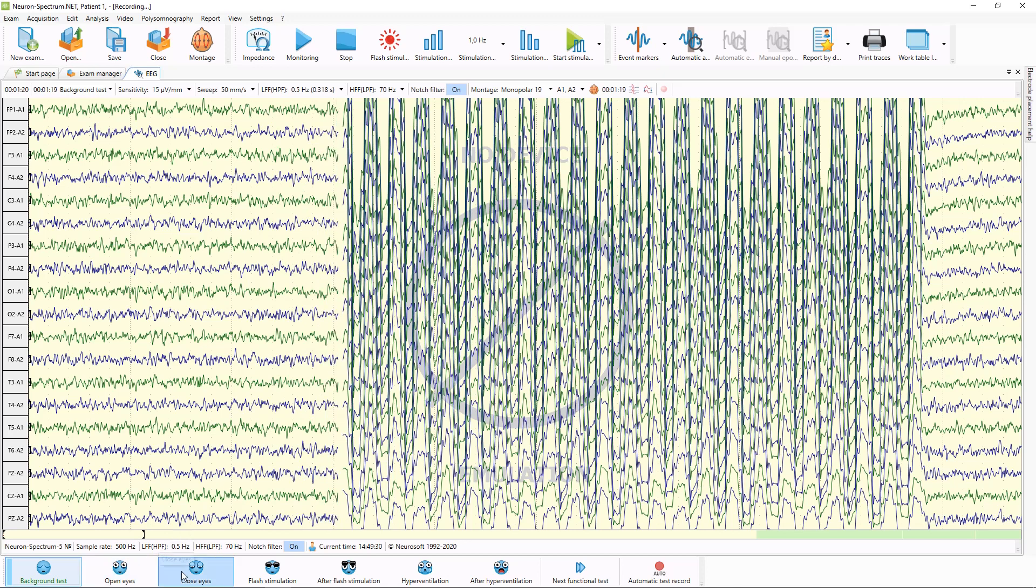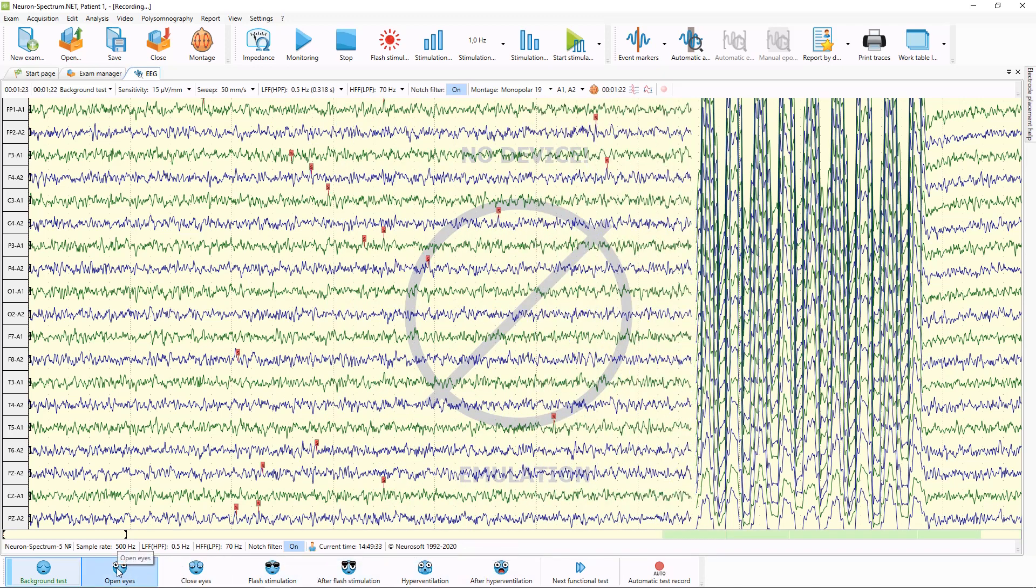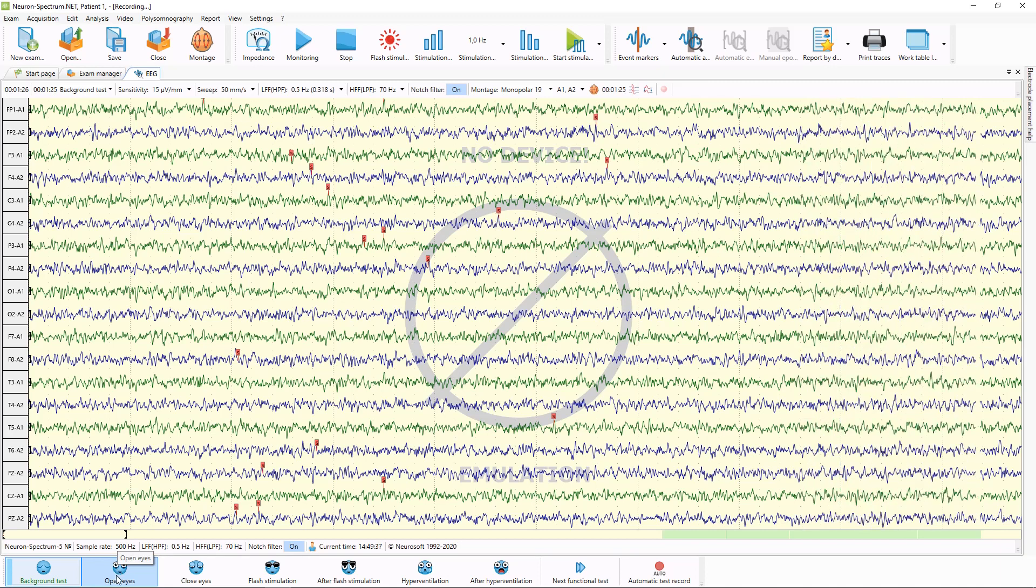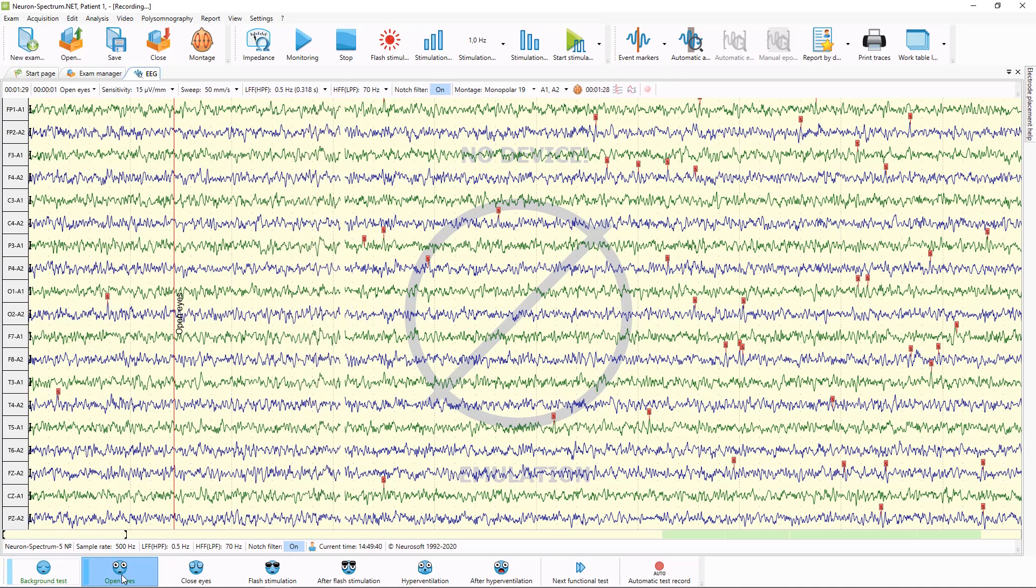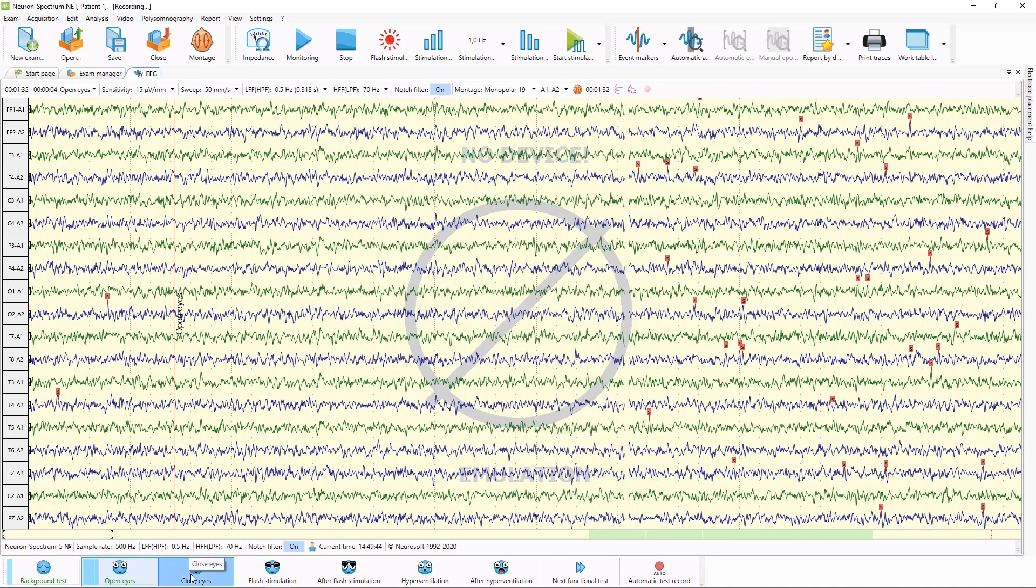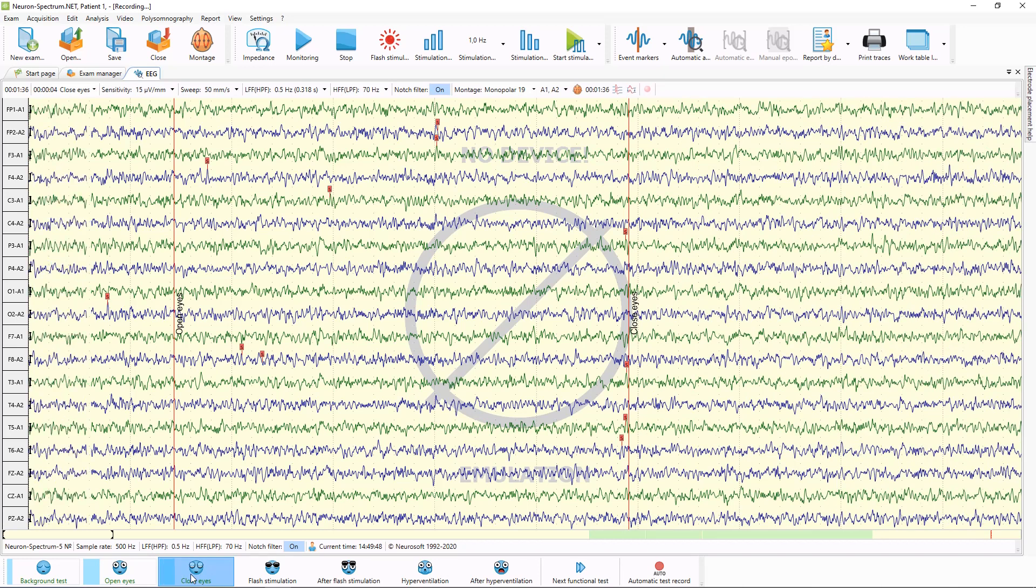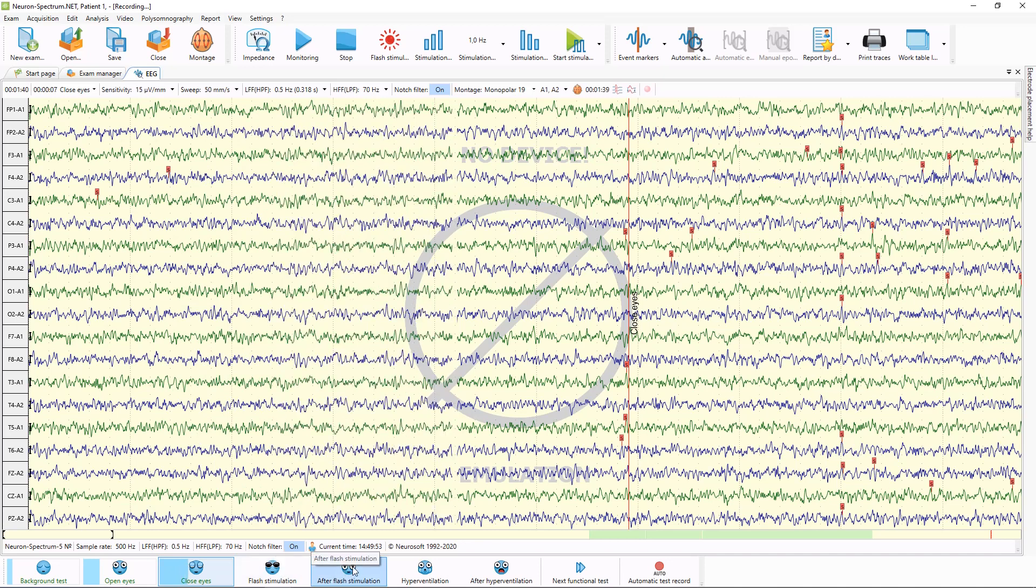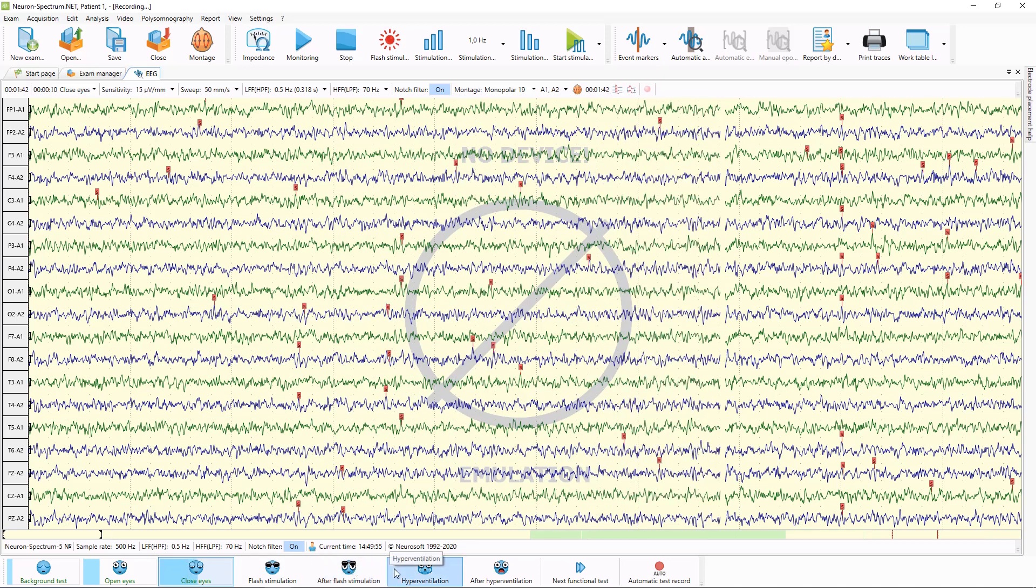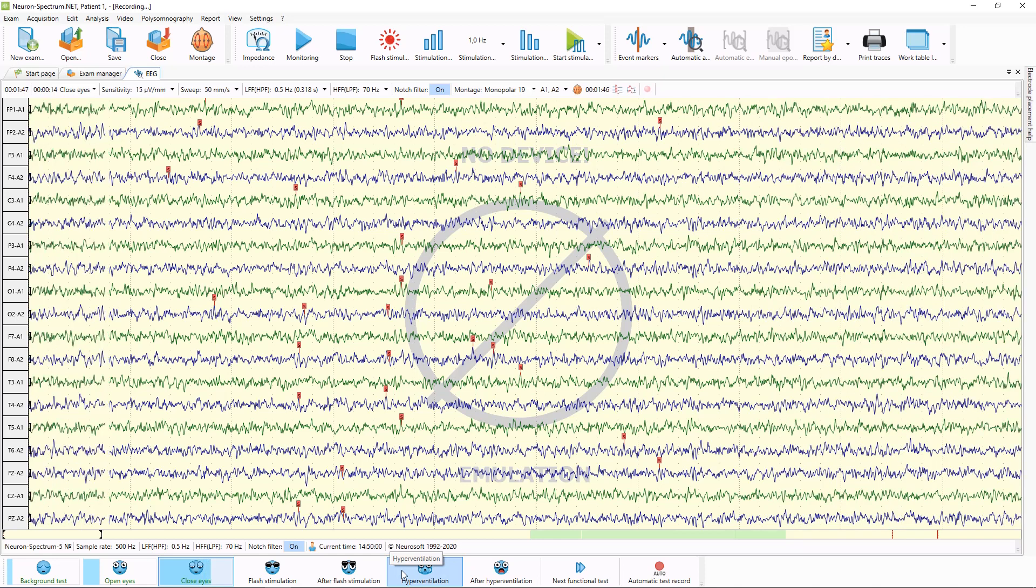Using these buttons, you can perform functional test recording. For example, when we finish background test, we can start open eyes functional tests, then close eyes. Here we need to ask patient to close his eyes. We can start flash stimulation and after flash stimulation functional tests. And also you can add your own functional tests here in program settings.